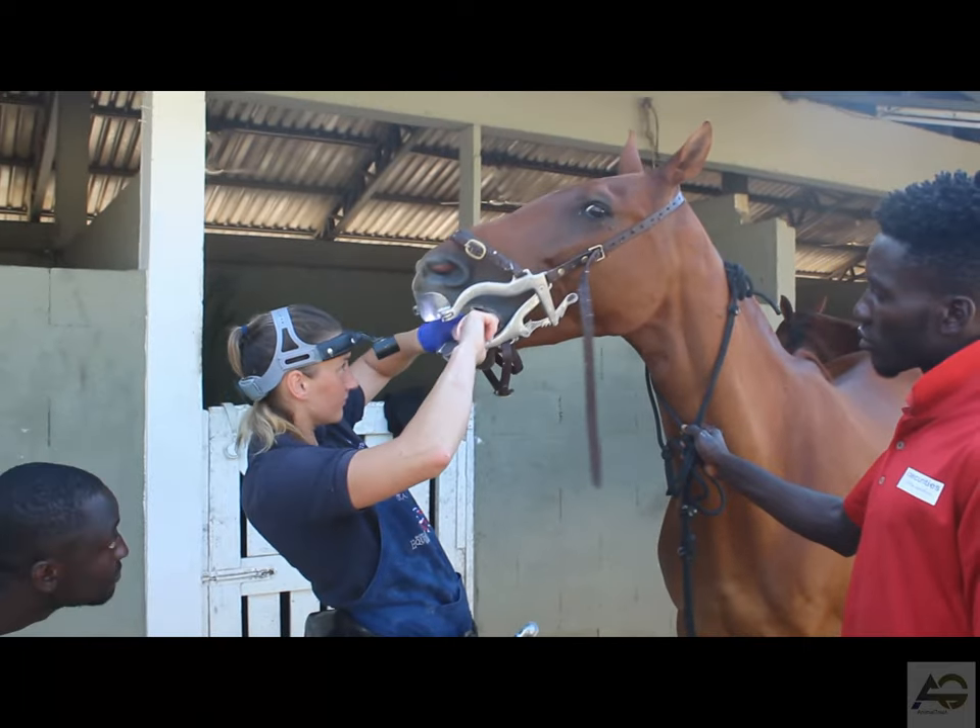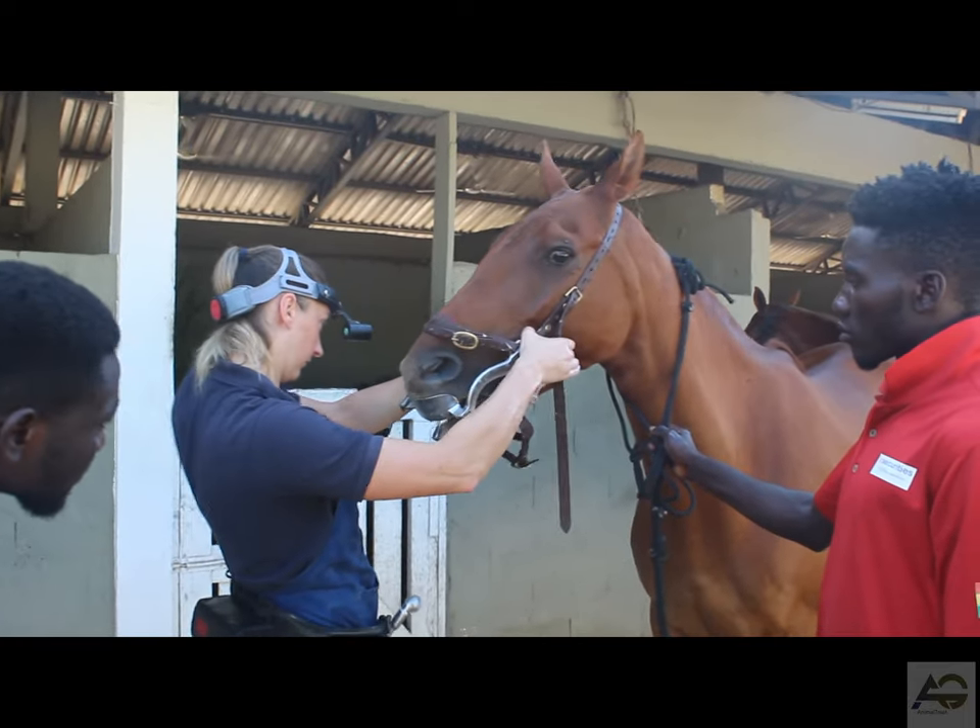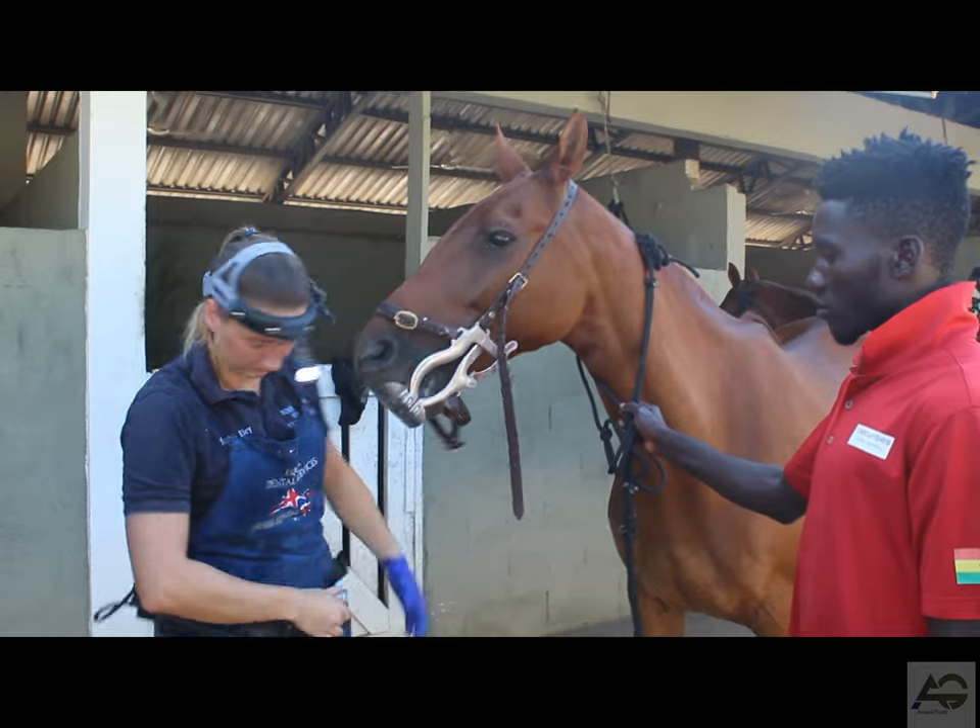Also make sure to check their mouth periodically for any new sharp edges that may have developed over time.